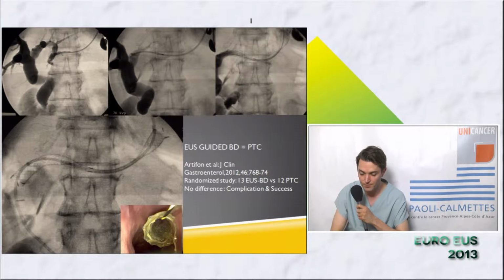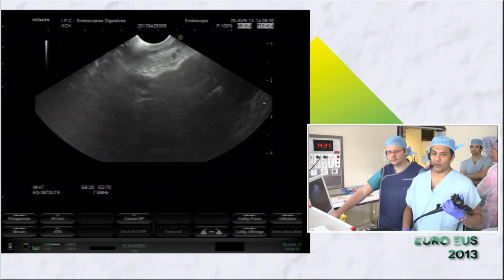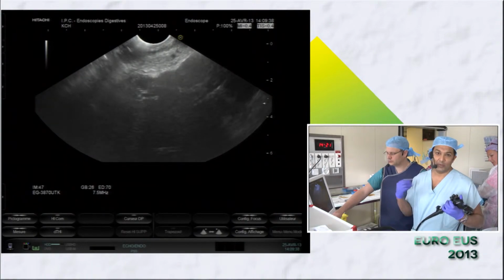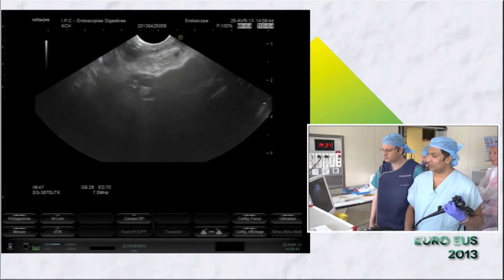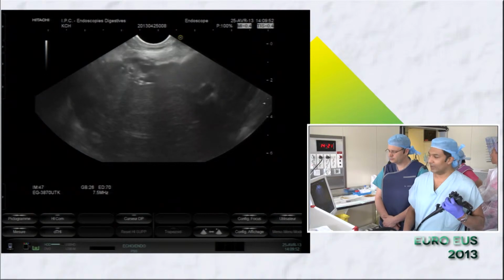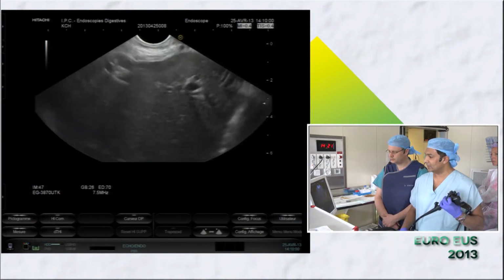Boris and Dr. Say. So in this patient, we're curious to see if the biliary obstruction is purely due to the progression of this ischemic stricture, or anyway, due to ischemic damage to the bile ducts, versus a recurrence. He is 1 year out from his surgery, so it would be a reasonable time to expect a recurrence as well. So as I go in, the first thing I want to do again is look at his liver to see if there's any signs of liver metastasis. I don't see any signs of liver metastasis.